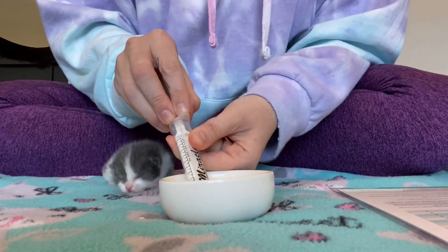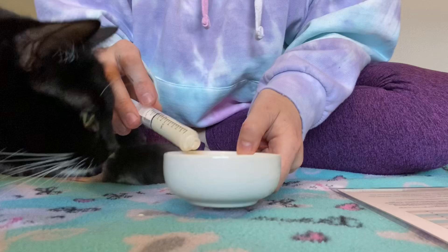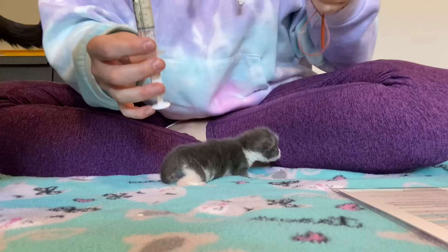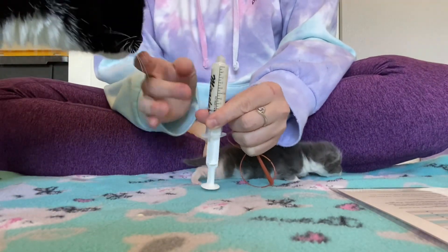Next, I am going to fill the syringe with the milk and I'm going to add a few extra cc's — you'll see why in a minute. You then flip that syringe over and tap it to get the bubbles to come to the top.